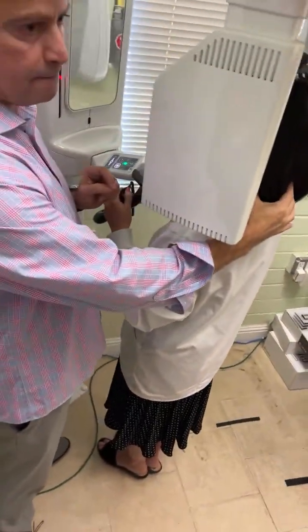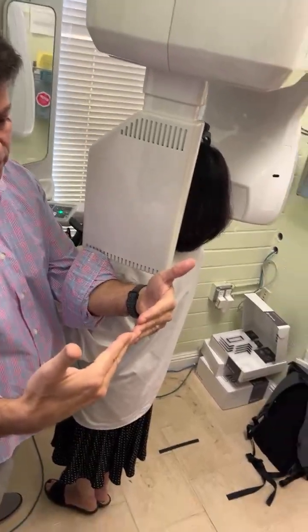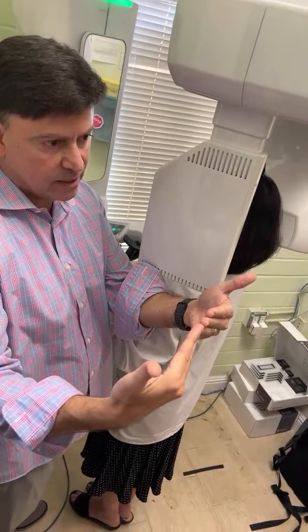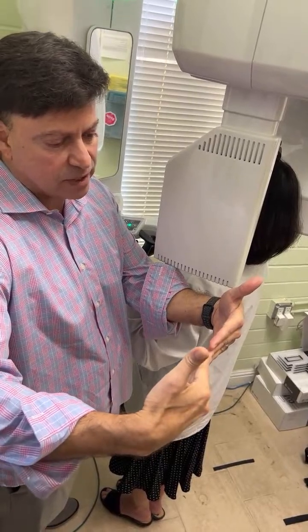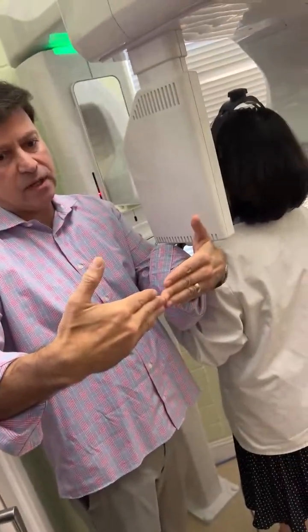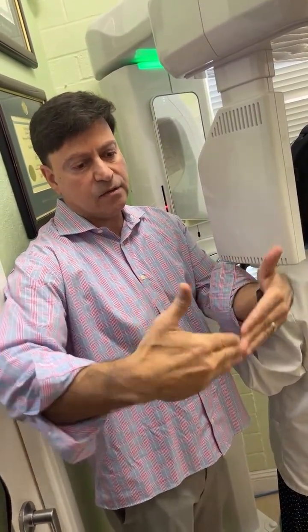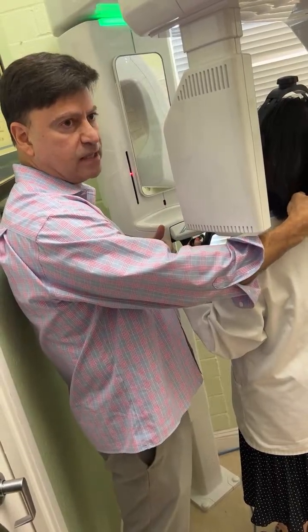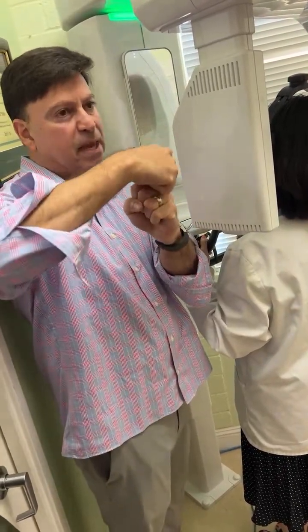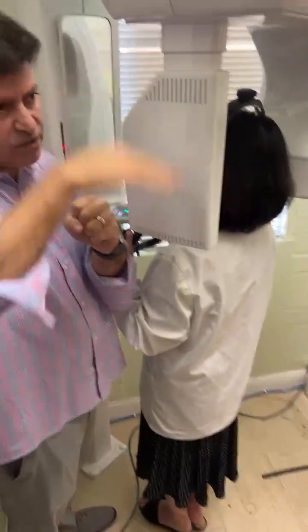Get them centered. Next thing we're going to do is this is their pano, their jaw. We don't want their chin too high, and we don't want it too low, and we don't want it flat. We just want a slight 5-degree tilt, and that gives us a nice panoramic x-ray with the condyles imaging straight up. If you don't do this, if this is like this or like this, you're going to get a lot of spinal streaking down the middle of the pano, which is a white streak, because the beam can't get through her vertebrae C1, C2, and C3 because they're basically getting pinched, closed off, and not all that x-ray can get through the vertebrae. That's why you see a streak.